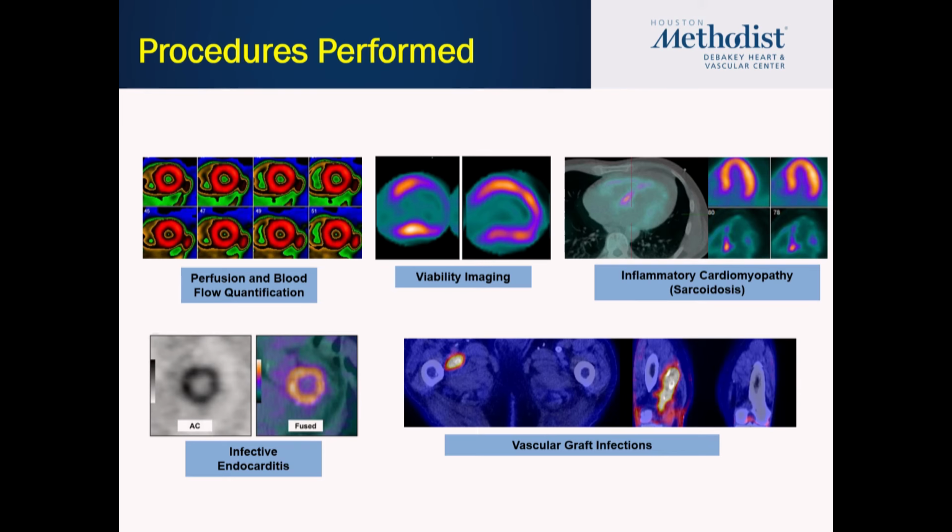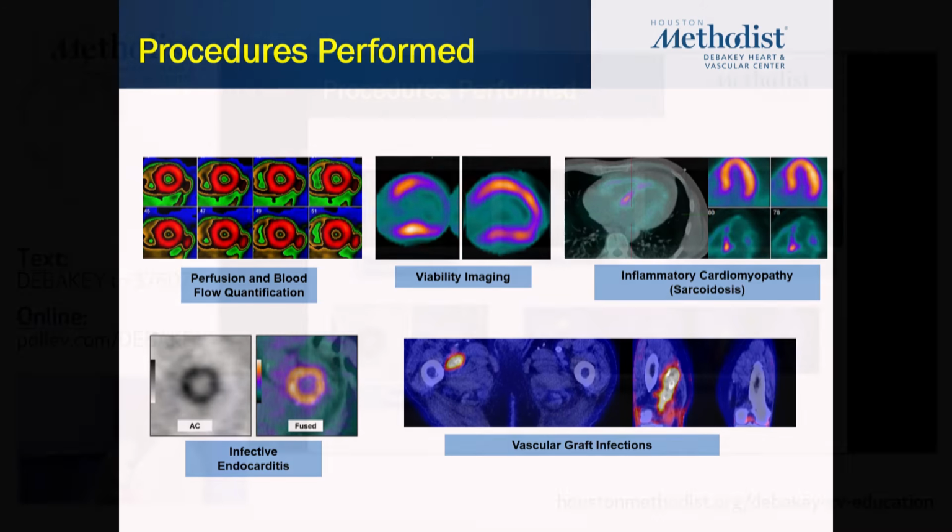Prior to transplant, many patients get referred for advanced heart failure and want to know what's the etiology of their cardiomyopathy. And part of it is that they get an MRI, and the MRI has shown scarring, and they want to know, is it actively inflamed or not actively inflamed. I think PET has a very complementary role there. And infection, whether it's in the hardware, in the prosthetic valves, LVADs, pacemaker pockets, all of these are very helpful. And we talked about aorta and potential other aortic implications.